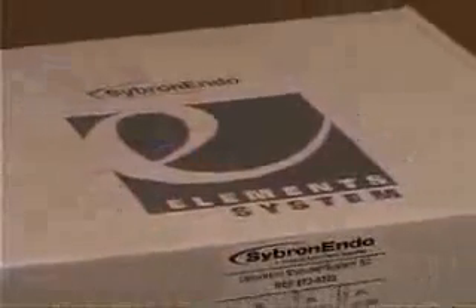Here's one of my favorite parts of getting a new toy — opening the box. Let's see what's inside: your instruction manual and the unit itself.